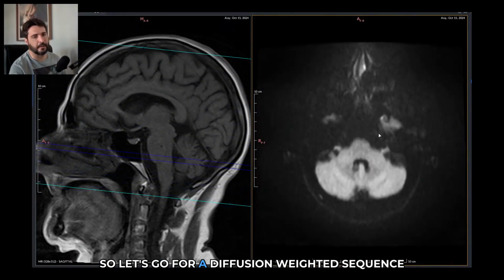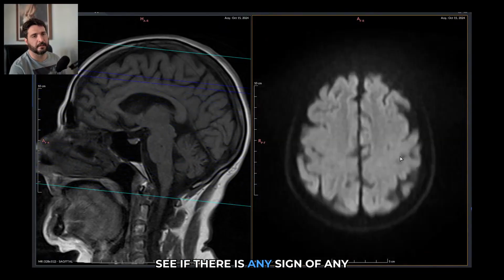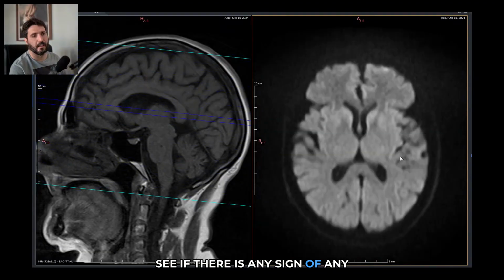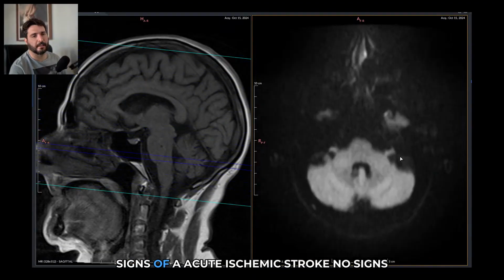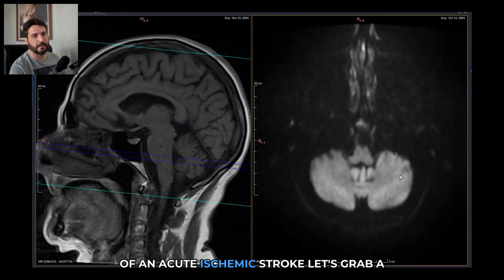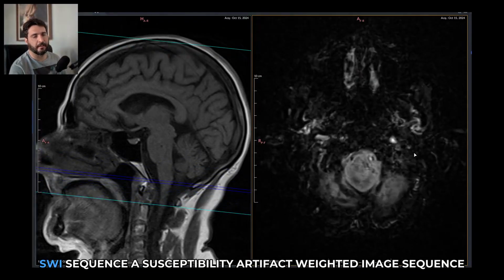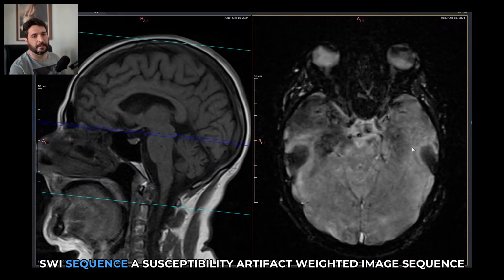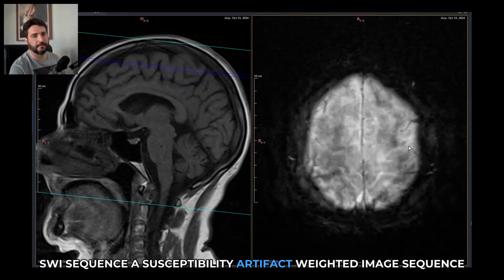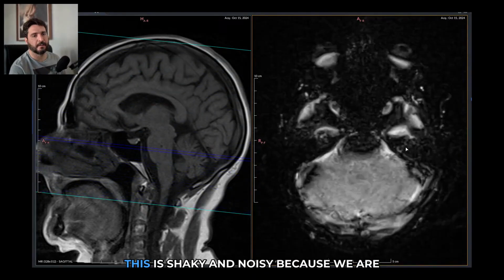So let's go for a diffusion weighted sequence, see if there are any signs of an acute ischemic stroke. No signs of an acute ischemic stroke. Let's grab a SWI sequence, a susceptibility weighted imaging sequence.